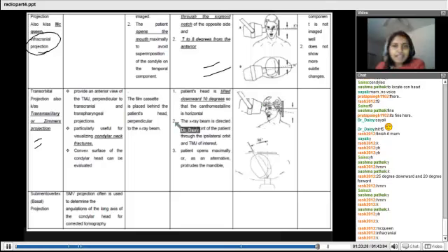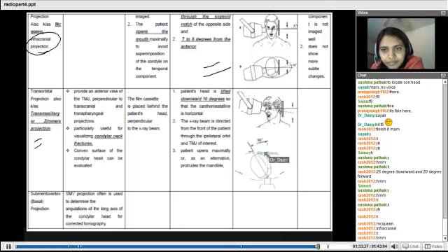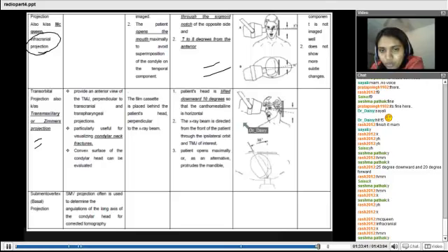Okay, look at this diagram. It gives a very nice imagination. Okay, this is the cassette. The canthomeatal line has been tilted down a little. Open the mouth, and through the orbit we are trying to pass through the side of the TMJ we want to examine. Look at the sideways tilting of 30 degrees of the head.